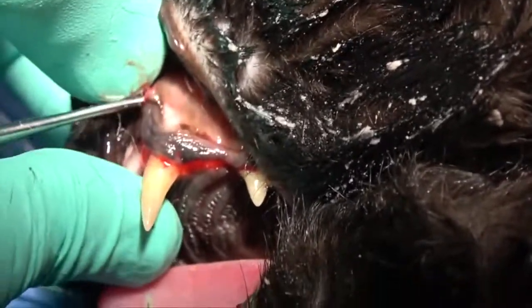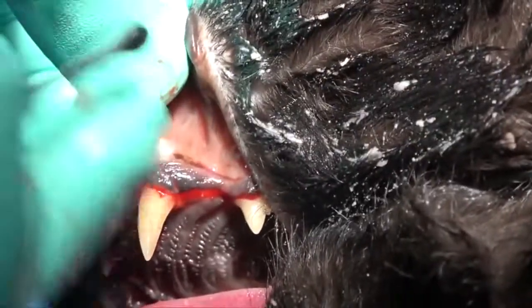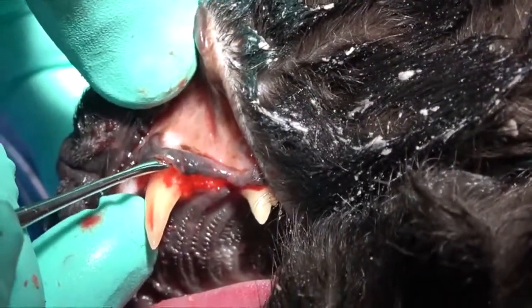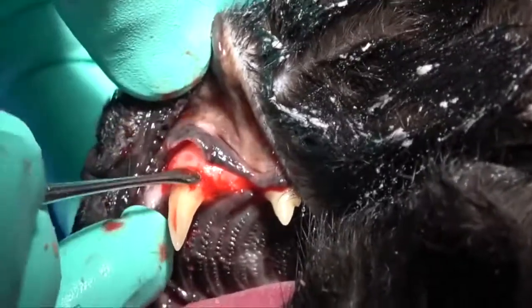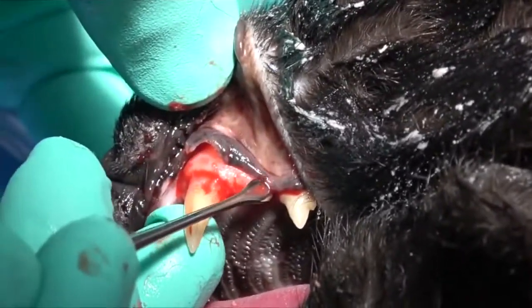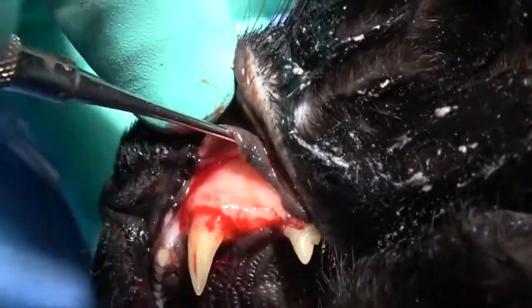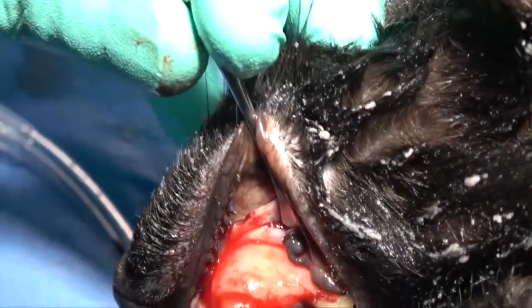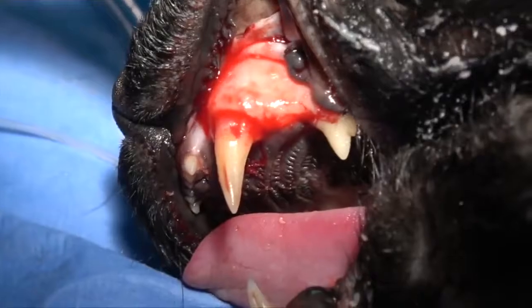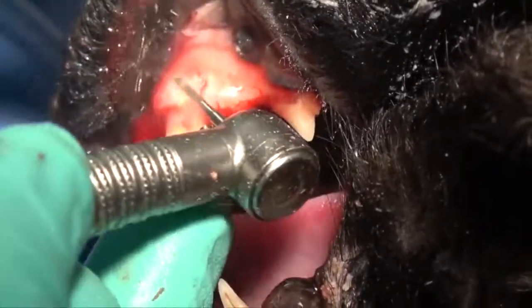But once you get some movement there, we can come in with the large end of the periosteal elevator — the large end of that EX9 — and utilize that to get more aggressive and work that unattached gingiva apically, resulting in a nice exposure. We'll now use that periosteal elevator to help us retract that tissue.